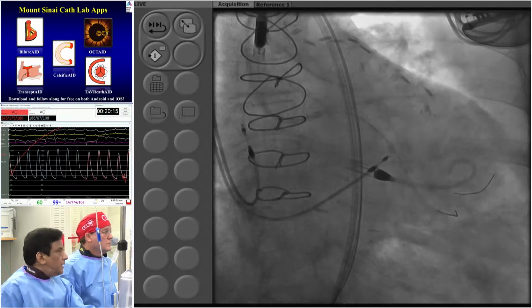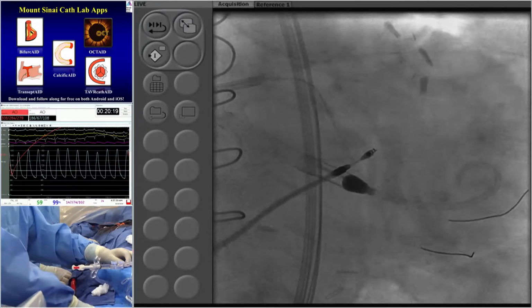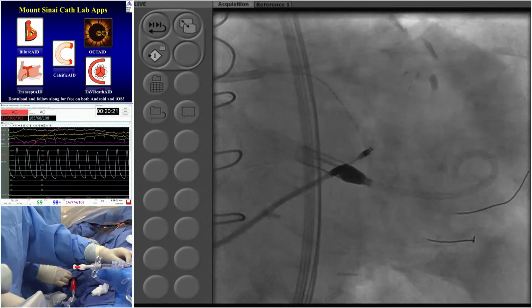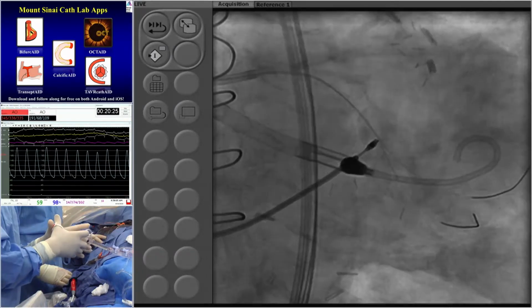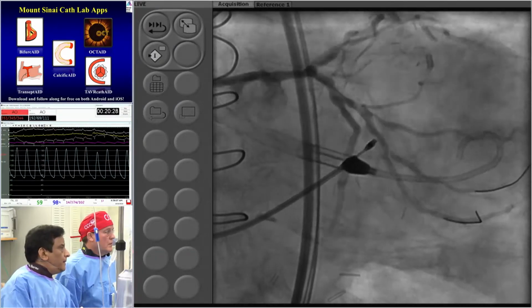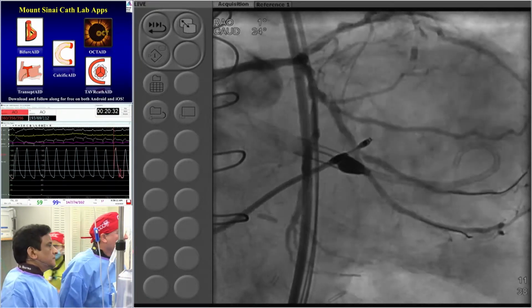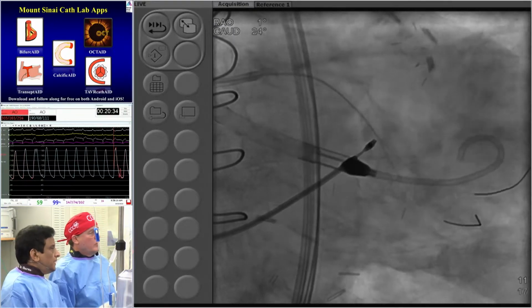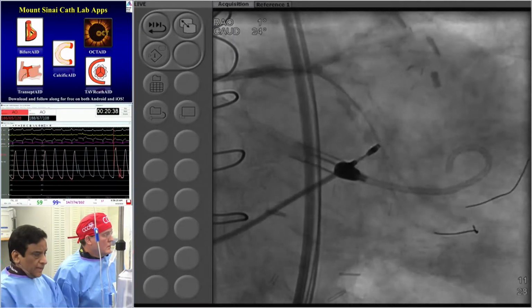Roxana, the point about which burr size to choose is often influenced not only by the length and the severity of the calcium and the severity of the lesion, but also the anticipated wire bias. In some cases, if it's straight ahead, 1.75 is better, but here you can see the wire bias coming around. You would generally use the 1.5 burr on this.